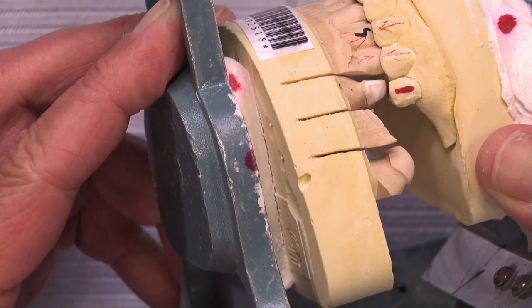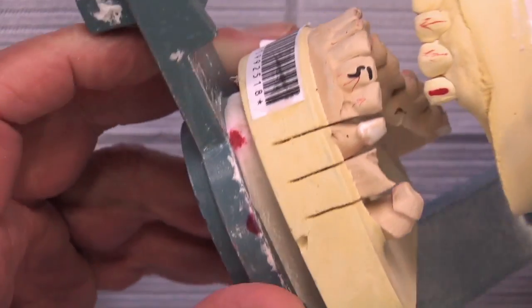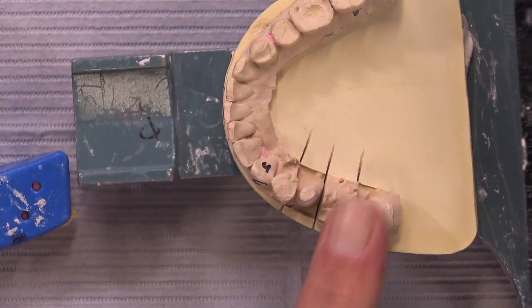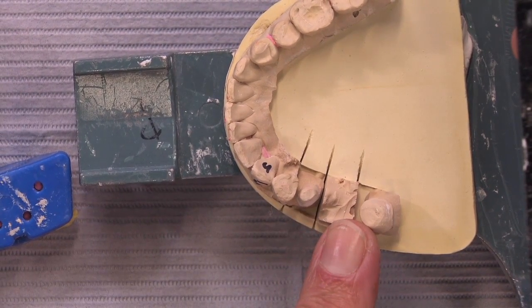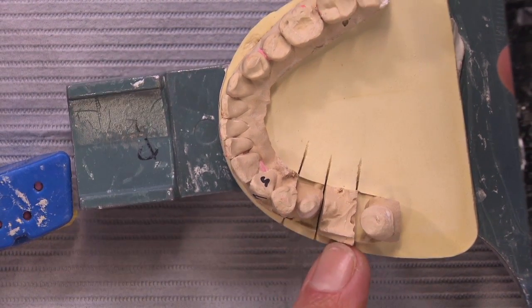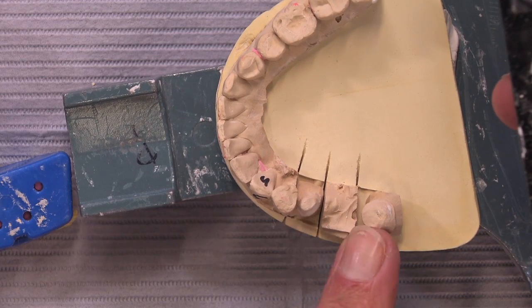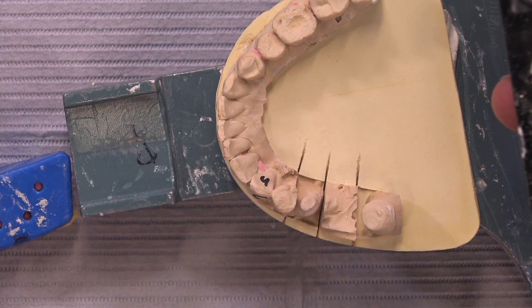And again, we've talked about these BruxZir bridges before on this show. I would not fault any dentist who wanted to do a PFM bridge here. In fact, I would consider doing a PFM bridge here myself because it does go back to a second molar. In fact, I'll just come right out and say it. I would have done a PFM bridge here.